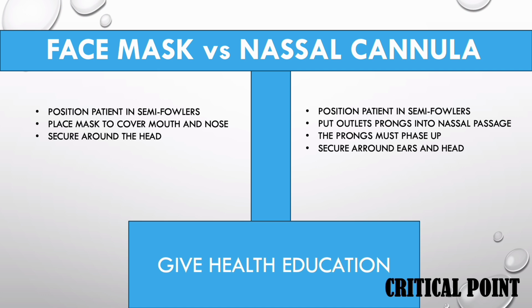Once everything is done, give health education to the patient about the oxygen therapy in totality. To avoid cross-infection by another patient using the same mask that your patient will be using, make sure that you label your mask accordingly by including the patient's name, registration number, and date the mask was applied.